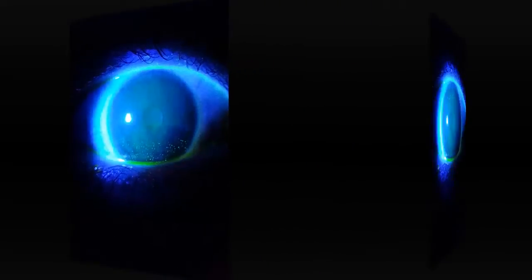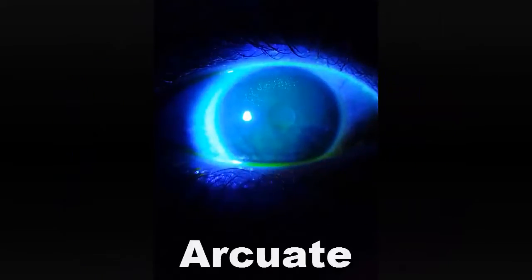We call this arcuate staining. Why does this happen? You have to start thinking about how tight this lens is. Look at the edges — are they properly blended or finished? How do you fix it? If you're keeping the same lens, send it back for further blending of transitions, or even polishing or re-edging. You might have to reconsider diameter or optic zone sizes.